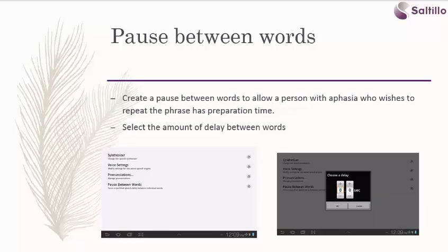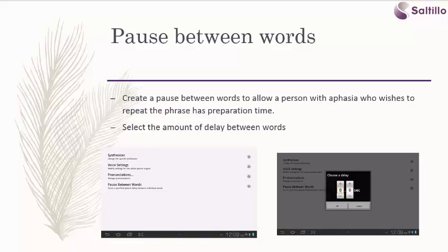Another useful setting is to add a pause between words. This allows a person with aphasia who wishes to repeat the phrase more preparation time. Let's take a look.